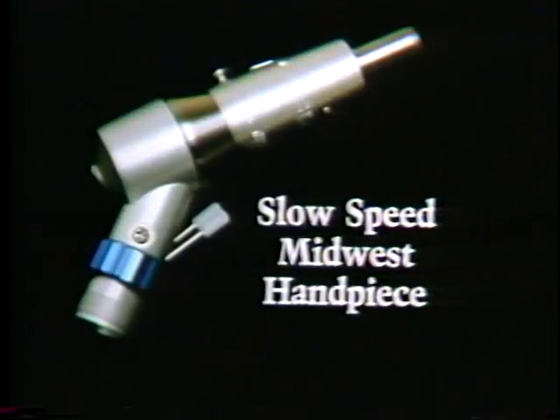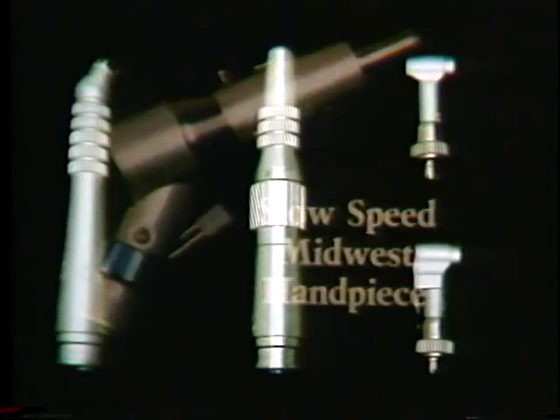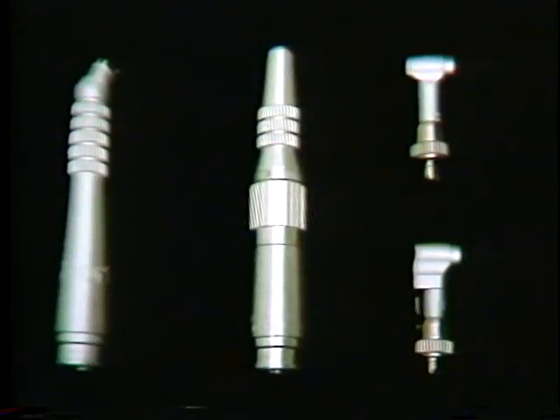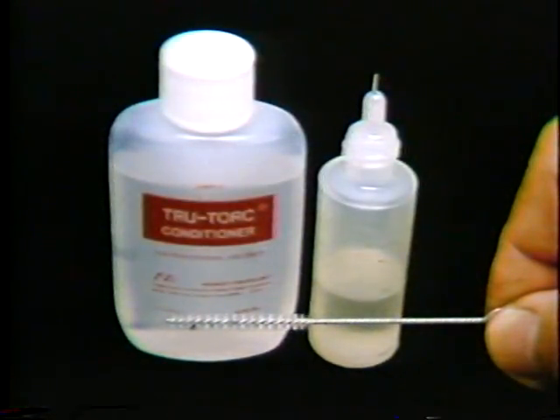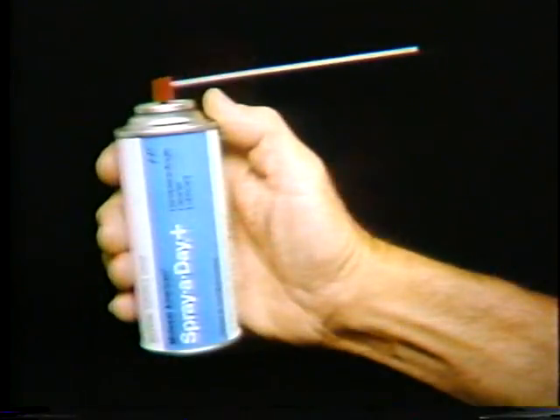The slow-speed Midwest handpiece also requires regular maintenance if it is to stay in good operating condition. This handpiece system includes the Midwest shorty motor, straight and angle attachments, and 2 contra angles, the latch type and friction grip. In your Midwest handpiece kit, you'll also receive a bottle of True Torque conditioner, a True Torque dispenser, and 4 or 5 small brushes. And you'll get a can of spray-a-day with your contra angles.